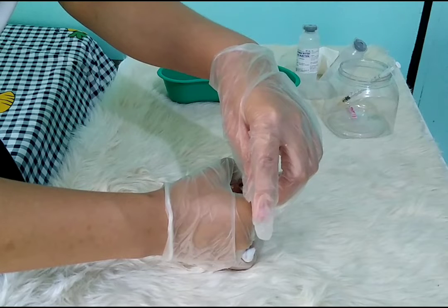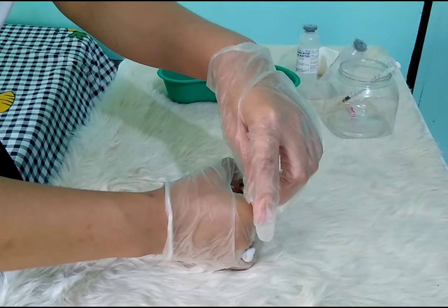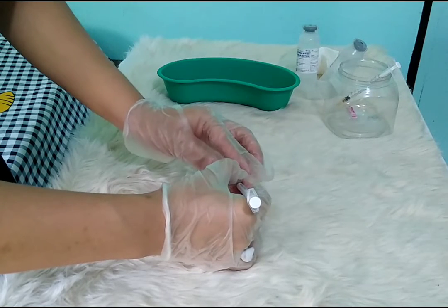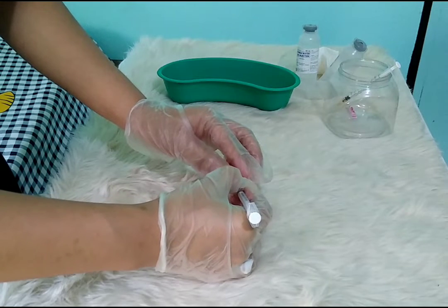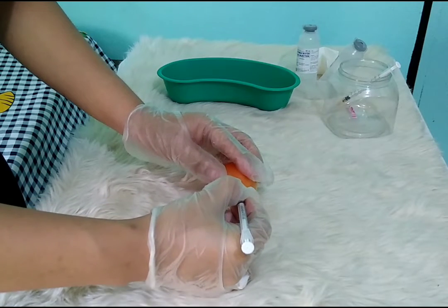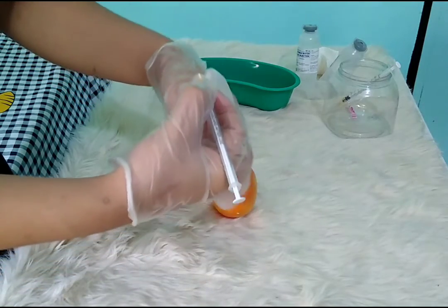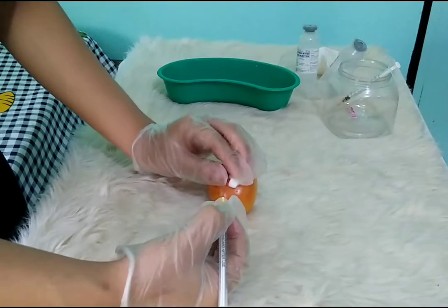Inject the medication by holding the syringe steady and depressing the plunger with slow, even pressure. Remove the needle smoothly, pulling along the line of insertion while depressing the skin with the non-dominant hand. Apply pressure to the site with dry sterile gauze if bleeding occurs.